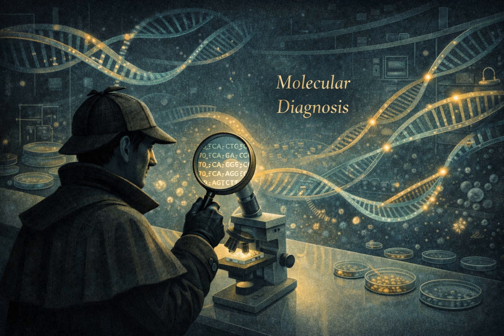Very clever. Then we have the one I see in the hospital all the time on order forms, multiplex PCR. Yeah. The respiratory panel or the meningitis panel. Multiplex is all about efficiency. Instead of running one test for one bug, you put multiple different primer pairs into the very same reaction tube. So you're hunting for multiple suspects at once. At the same time, in the same sample.